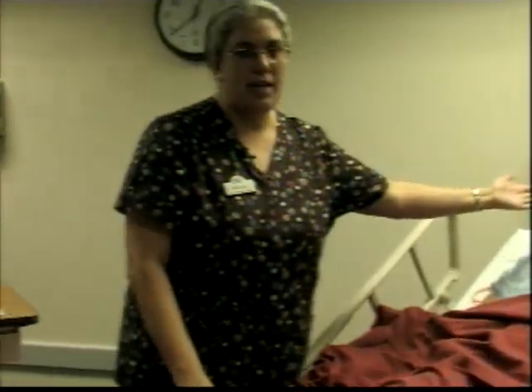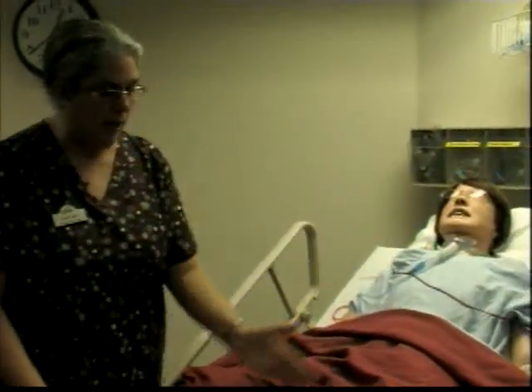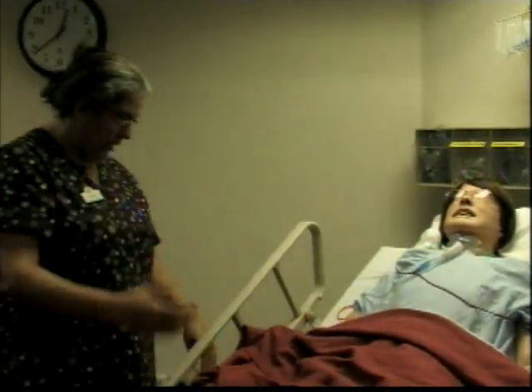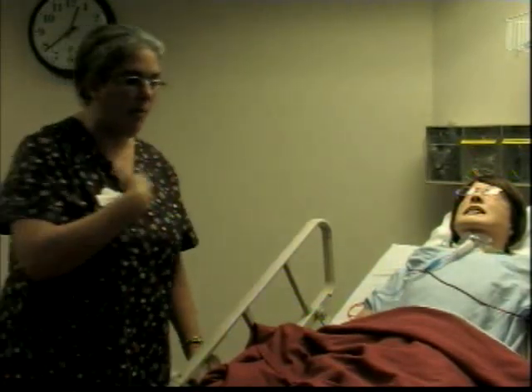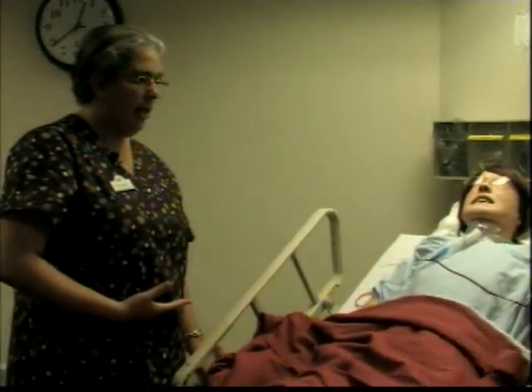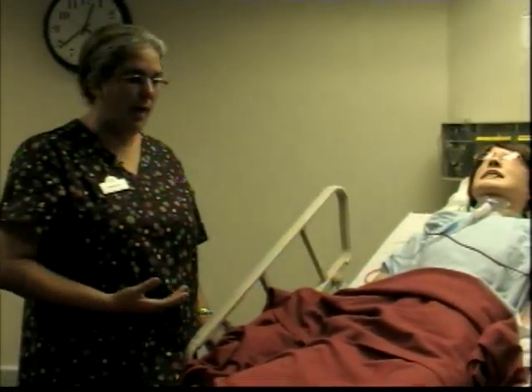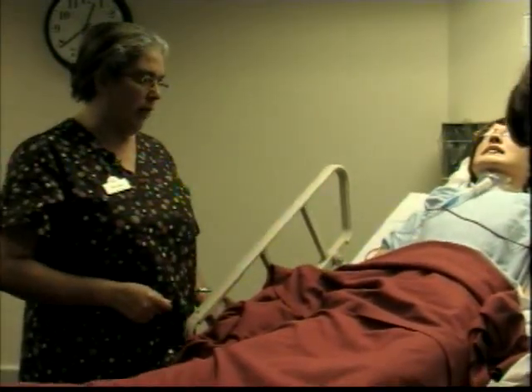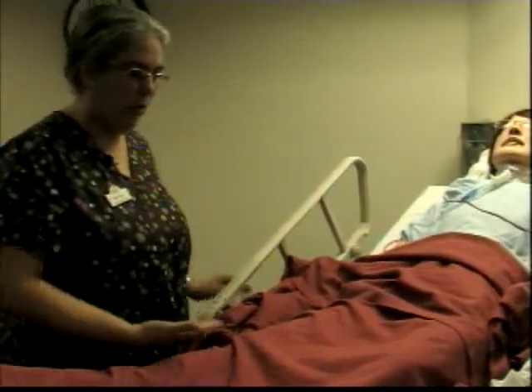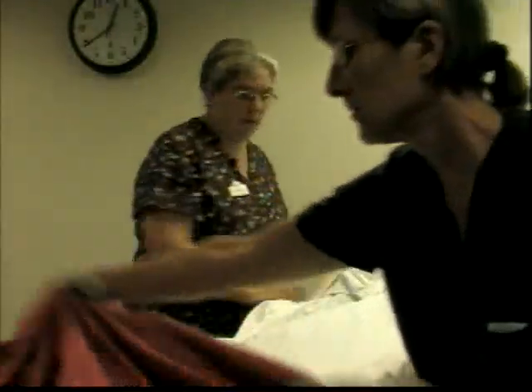She has respiratory issues, so she's going to be slightly elevated, which helps with bladder relief. This is a skill where you also want to be comfortable yourself — remember, you're going to be bending over. Make sure the rails are down and the bed is at a comfortable position for you. You have to remember to put the whole bed down before you leave.